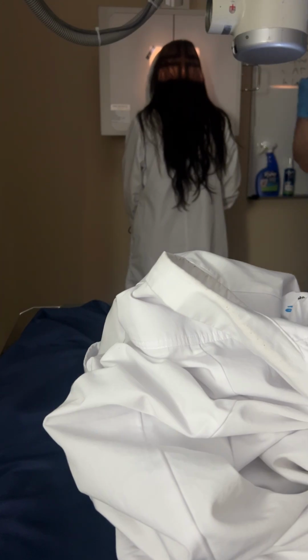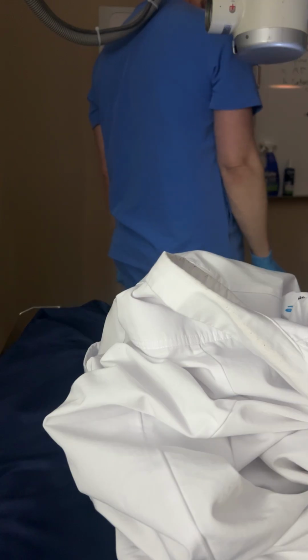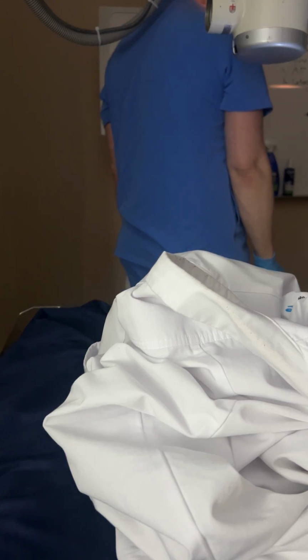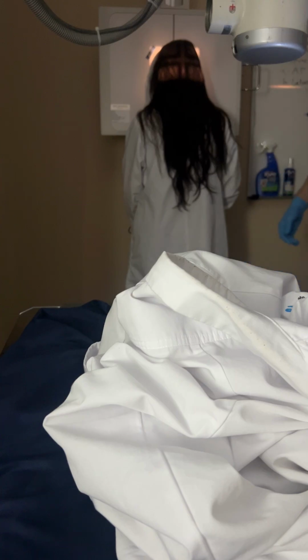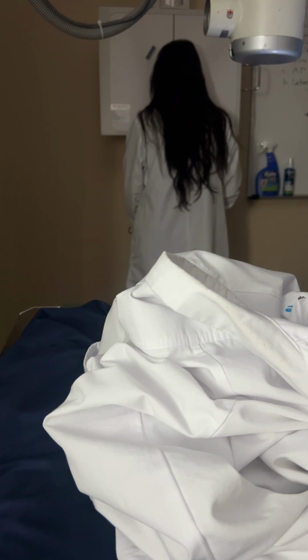Exiting nasion. If you want to come over and take a look close, you can. You can see that my CR is coming out of her nasion right here, okay? 15 degrees caudad angulation, and that OML is parallel to the floor. Questions? No? Okay. The CR is exiting the nasion, 15 degrees caudad angulation. Okay, parieto-acanthial, or Waters method. I love the Waters method. For facial bones? For facial bones. Okay, just making sure.